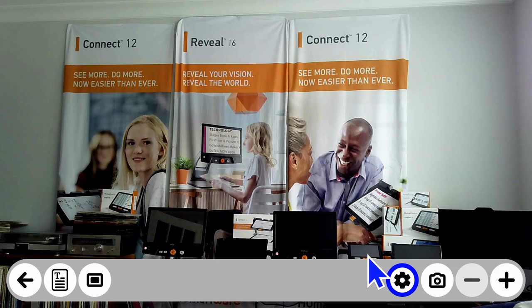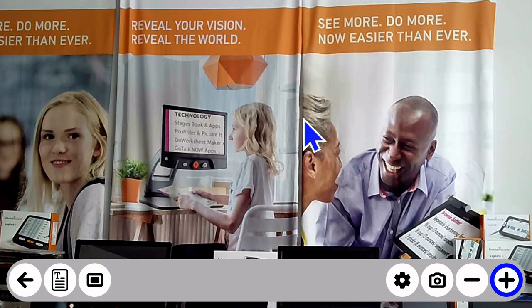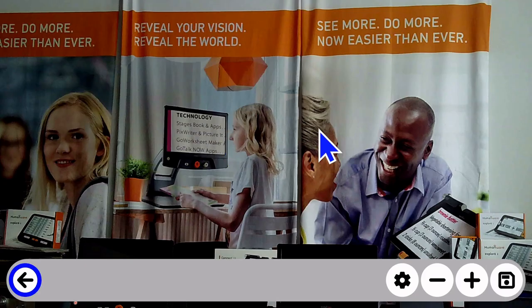So I will go into a live viewing mode here. Let's zoom in just a little bit. And let's say, oops, I clicked on my screen there. So I'm going to capture an image very quickly. So now we have a frozen image. This will work the same way though. On a touchscreen or with your mouse, you can adjust the contrast of the image you're seeing.